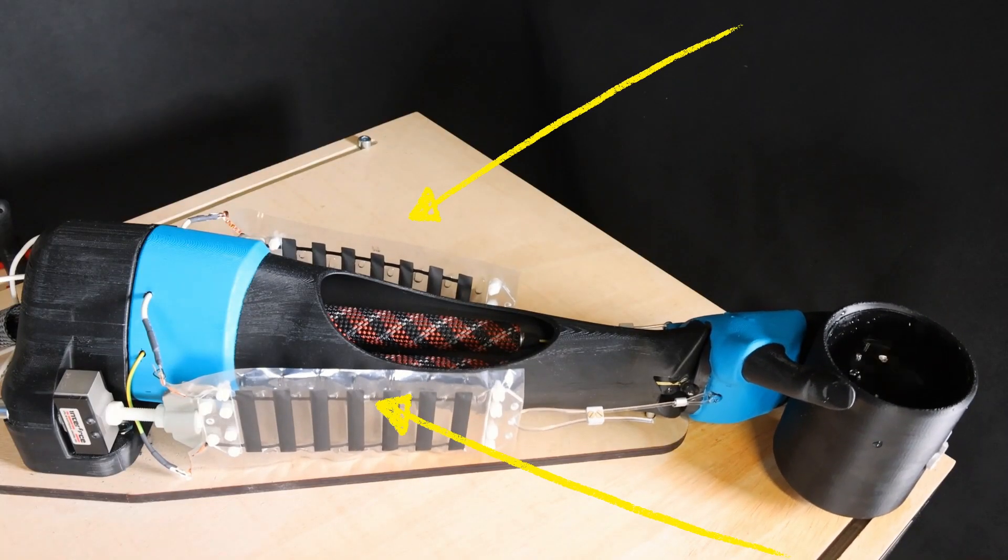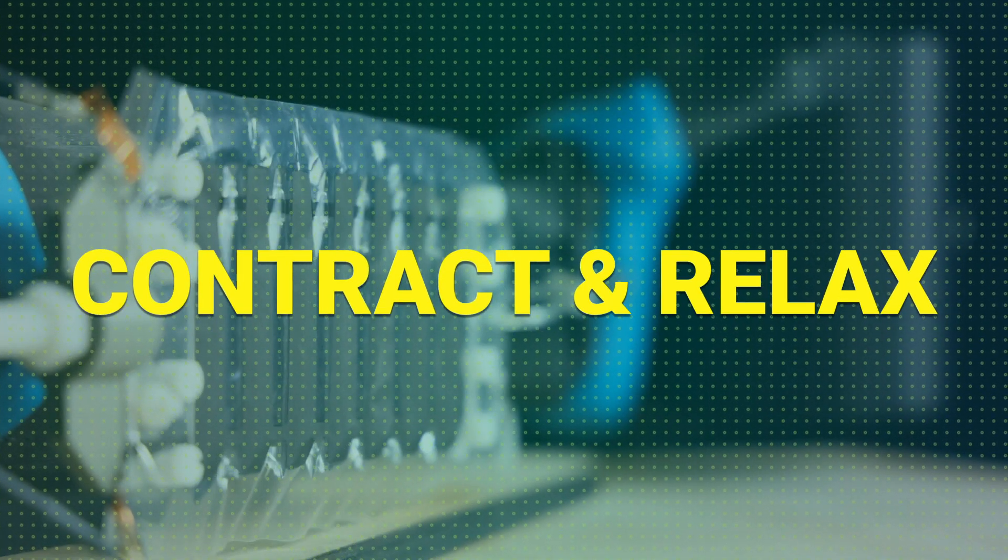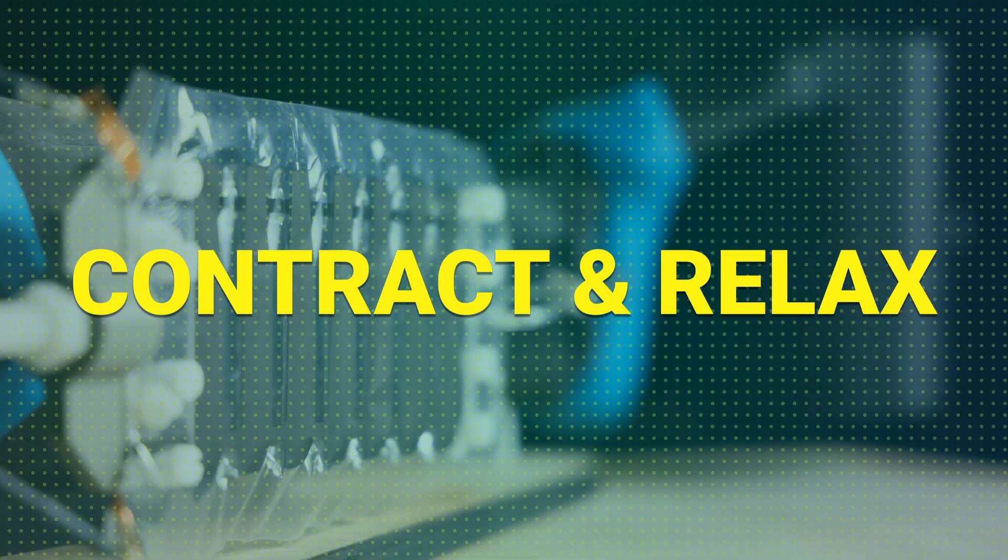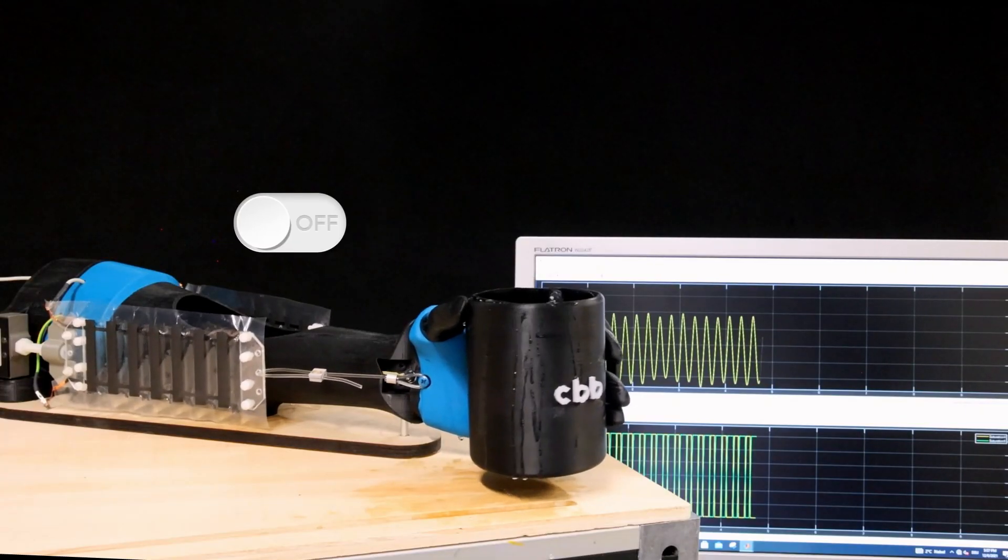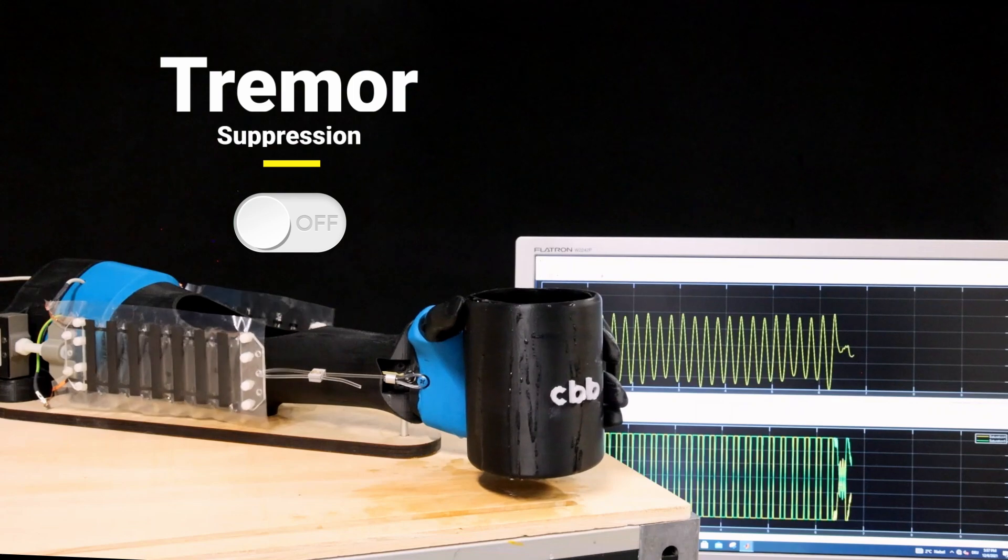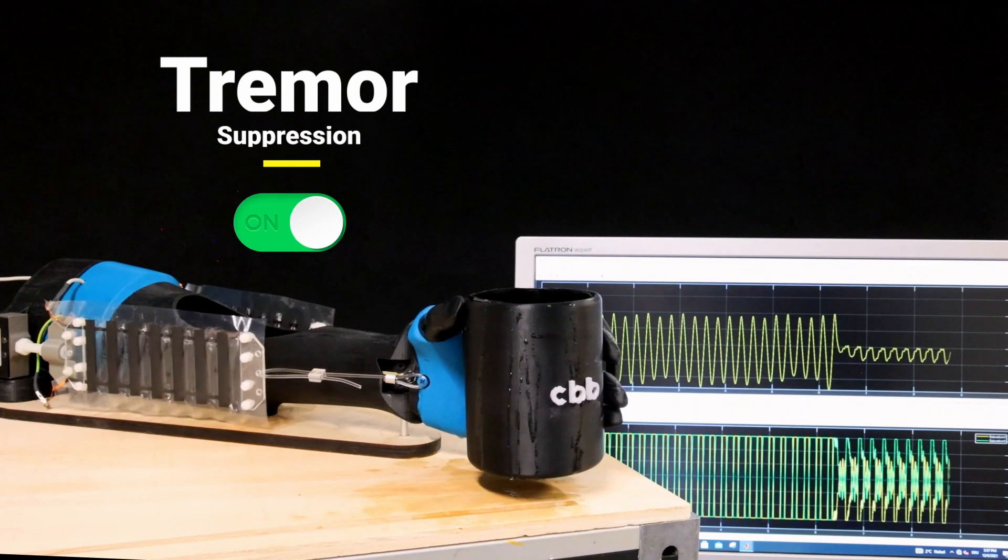Artificial muscles on either side of the forearm contract and relax to suppress the involuntary shaking of the wrist and hand. In this way, the robotic arm avoids spilling whatever is inside the cup.